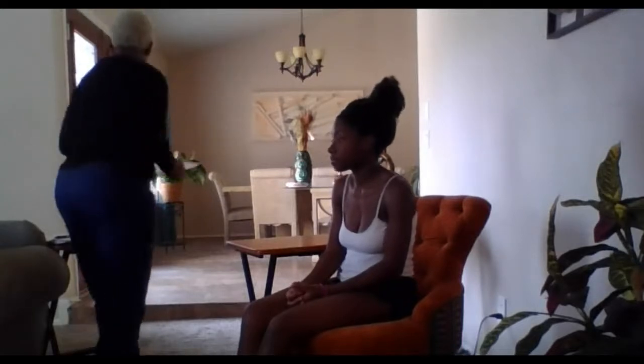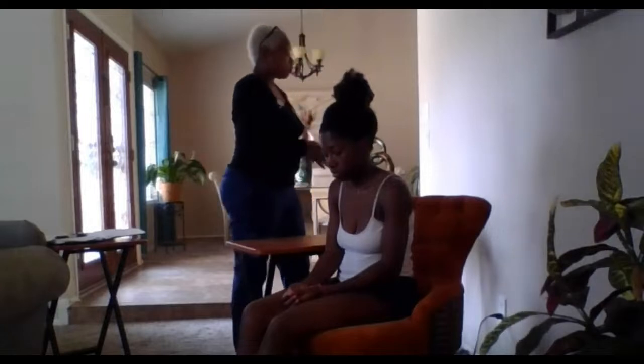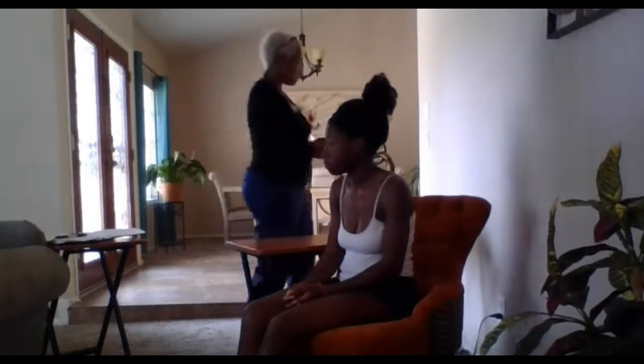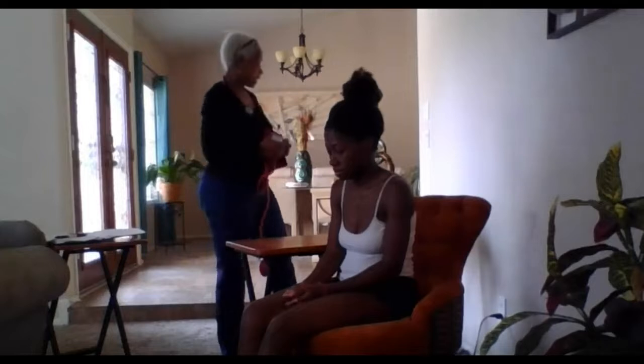Will you please state your first and last name and spell your last name? Kayla Howard, H-o-w-a-r-d. And can you please tell me your date of birth? December 5th, 1998. Okay, thank you. I'm going to start the assessment by washing my hands thoroughly. Okay, I've washed and dried my hands, and now I'm going to start the assessment by taking vital signs. And this is a comprehensive physical assessment.